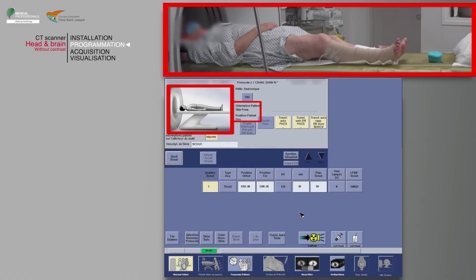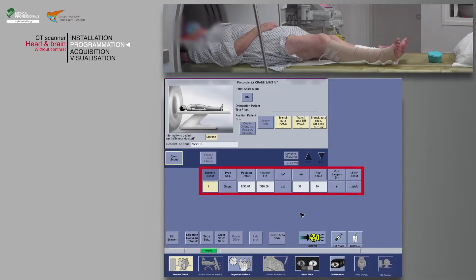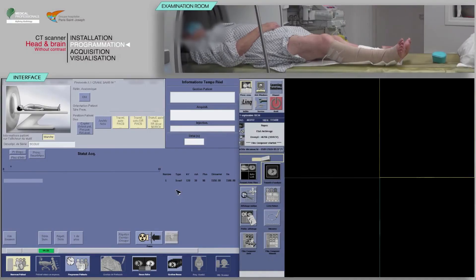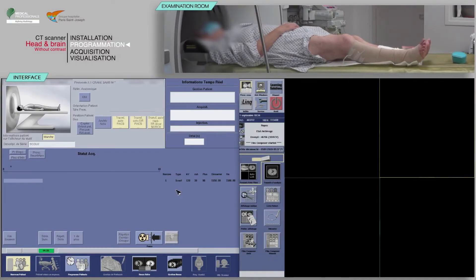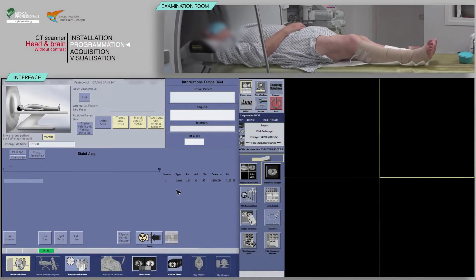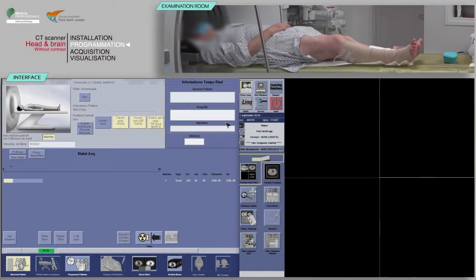Check that the patient's position on the table matches the one indicated. Note that the patient's orientation is head first. After checking the scan parameters, click Confirm. On the keyboard, move the table and launch the acquisition when the buttons flash.